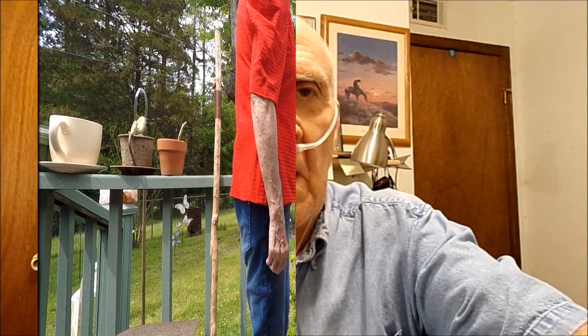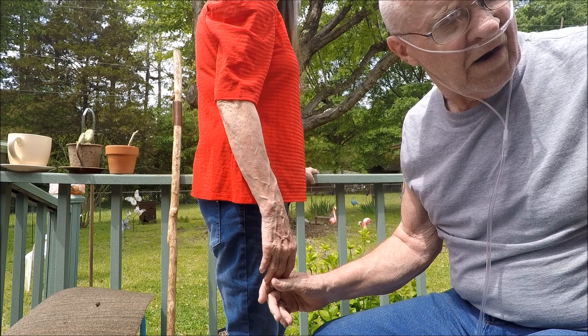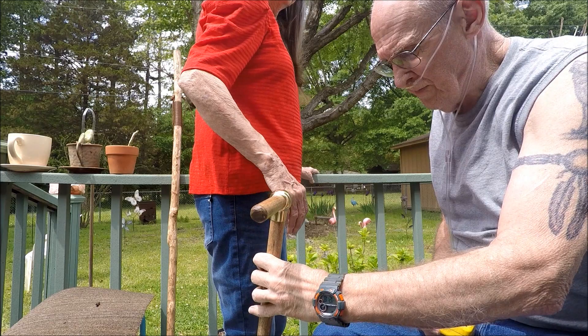Here we are out on the back deck with my beautiful wife. We're going to show you how to measure for a cane. This is the wife's cane, and you can see how her arm is positioned.